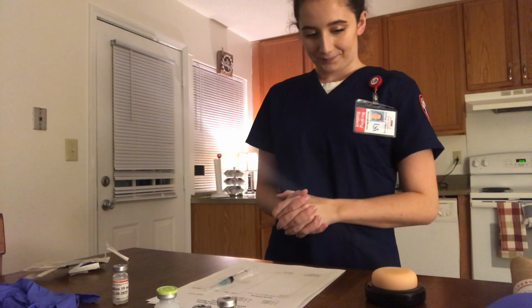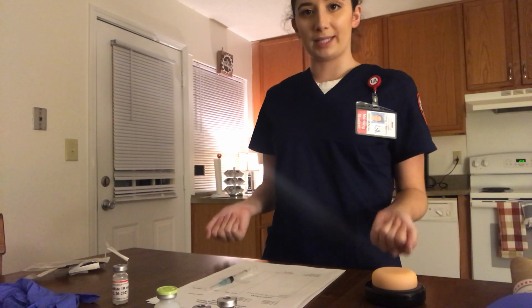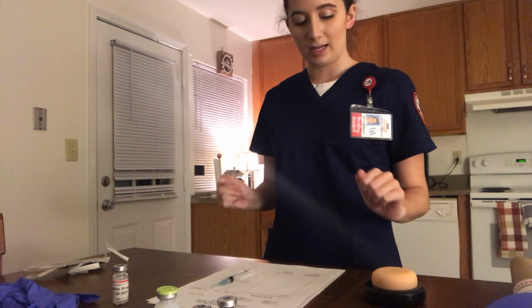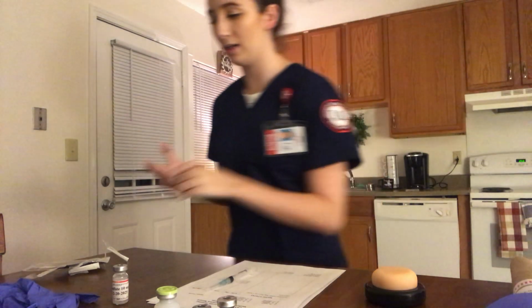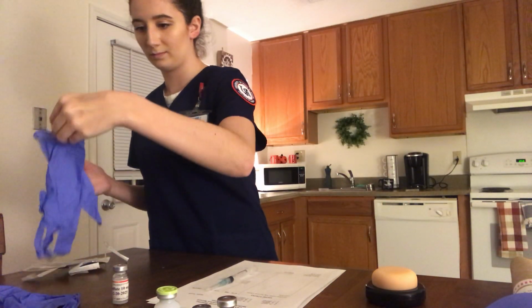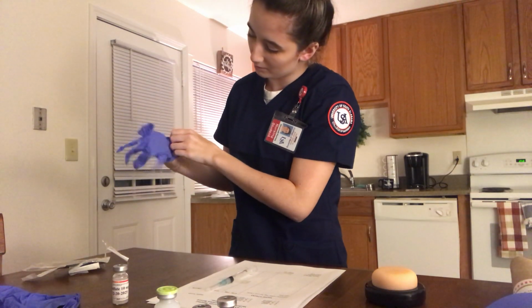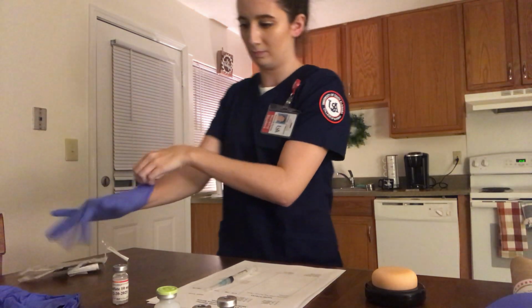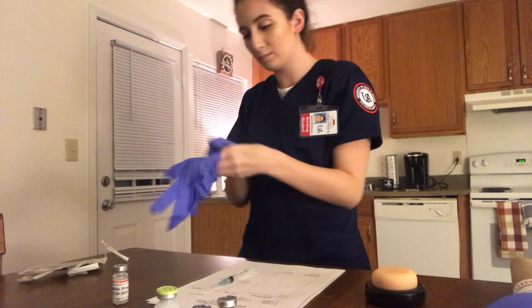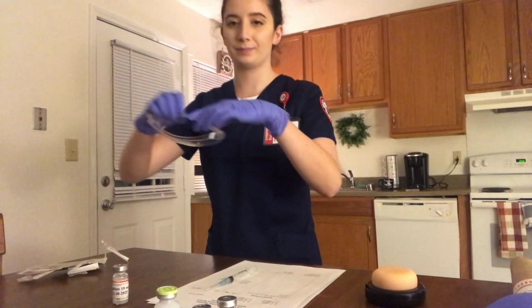I will then heighten the bed to a working position, lower the side rail, perform hand hygiene, and then put on my gloves and my goggles.